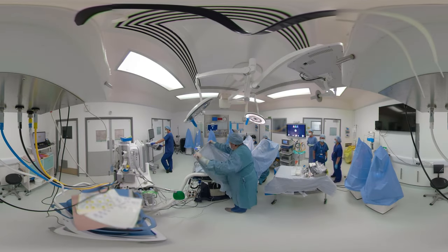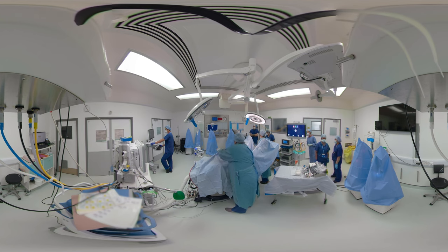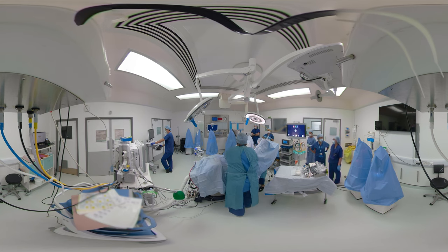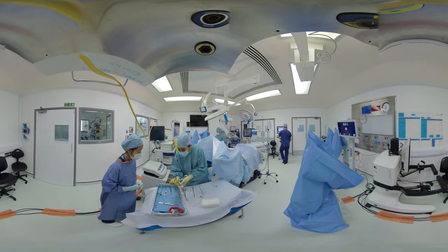Hi, my name is Nidhi Shandil Singh. I'm a consultant gynecologist at Milton Keynes University Hospital and I am going to show you today a hysterectomy performed with the Versius surgical robot. This is a 360 degree video and you would be able to scroll around and explore the theatre, or watch it with a VR headset.